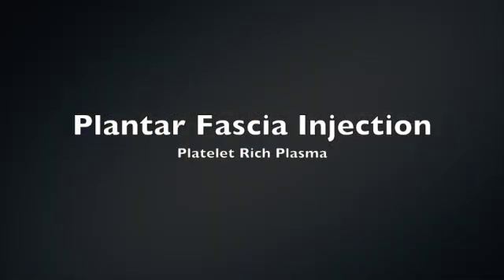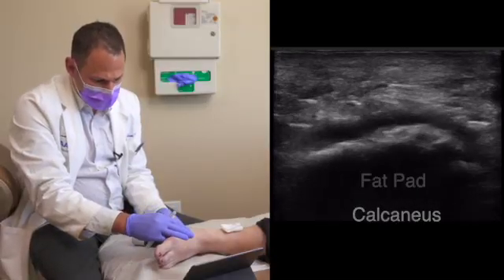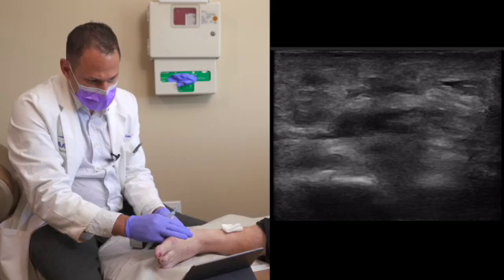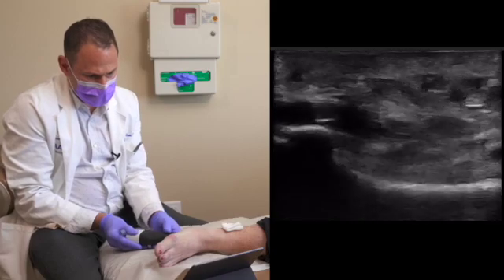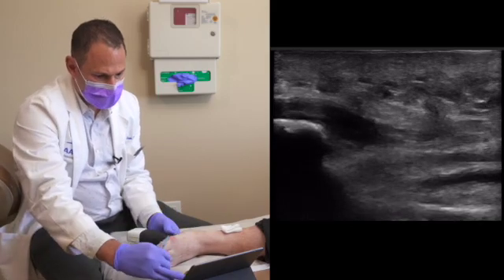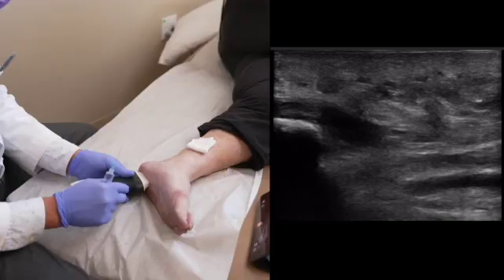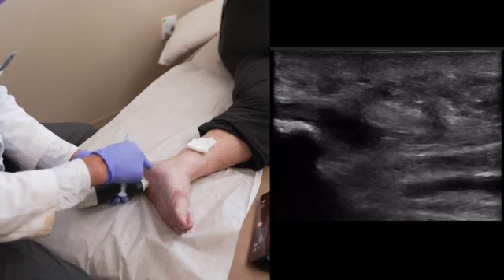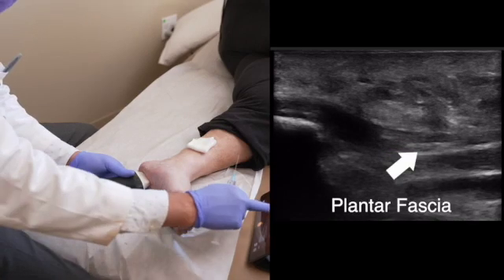Now we're going to image the plantar fascia. I put my probe underneath the calcaneus. The fat pad is the most superficial, followed by the beginning of the plantar fascia. As I scan distally you see the fascia. I'm going to turn my probe transverse. My point is anterior to the calcaneus — that's where I enter my needle, aiming towards the center of her foot. The plantar fascia is this layer right here.